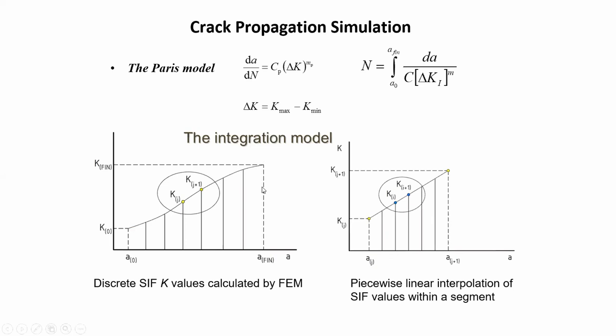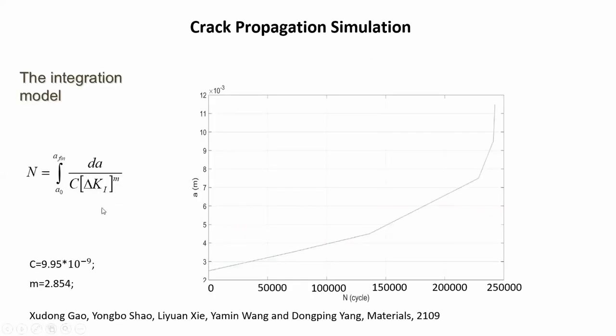By using this procedure explained on the previous slide, by integrating Paris equation and assuming material constants C and m provided with this reference here, we have calculated total fatigue crack growth life for the considered prosthesis. It should be emphasized here that this result highly depends on C and m constants. Also, total fatigue crack growth life can be influenced by corrosive environment which exists in human body. For good results, these constants should be determined or taken as accurate as possible.